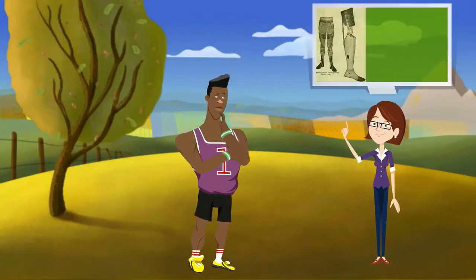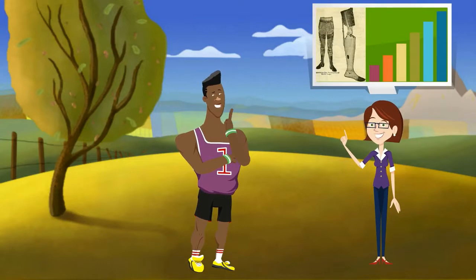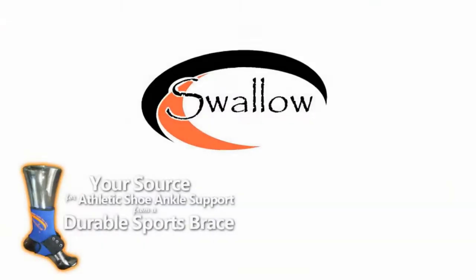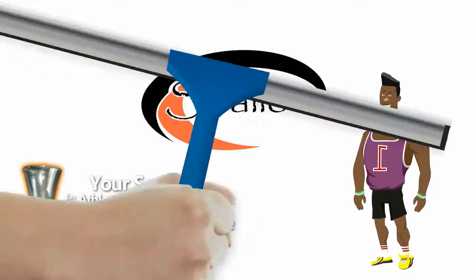Are you an athlete looking for an ankle brace at an entry level? A brace that will give you professional support? Swallow Ankle Brace is what you need.